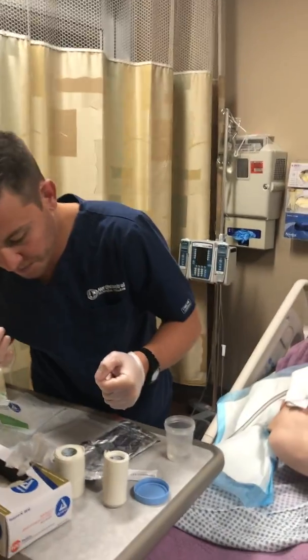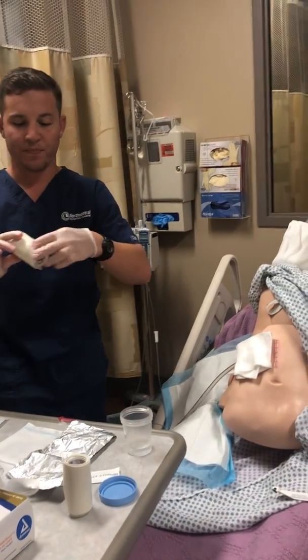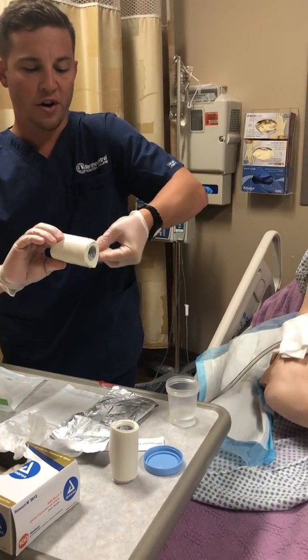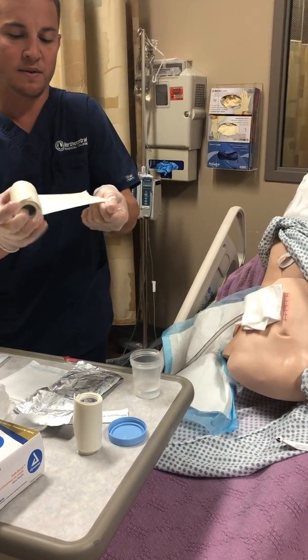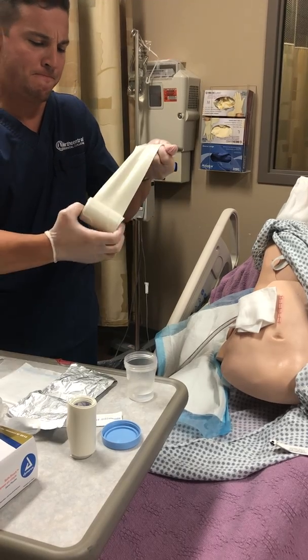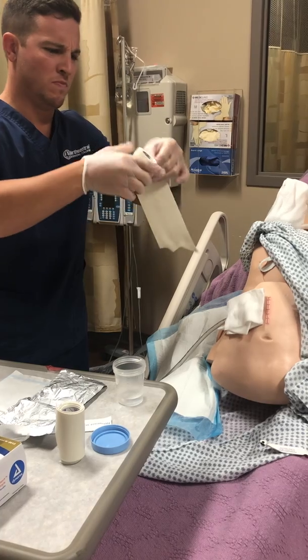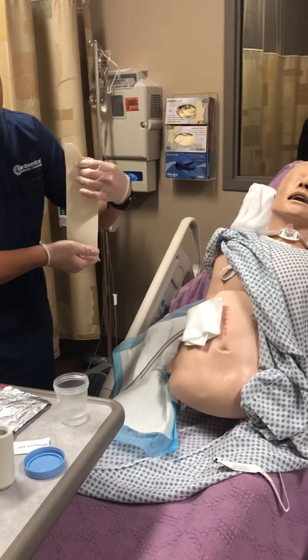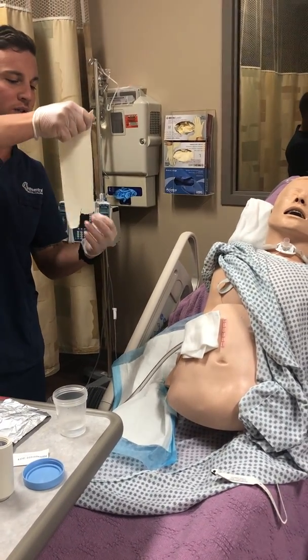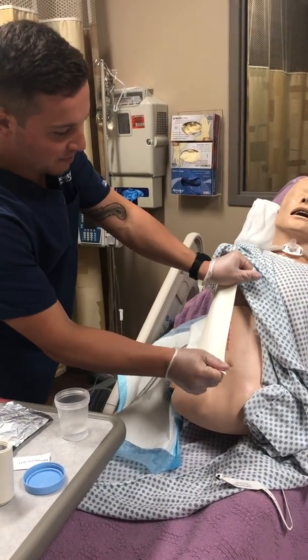Okay, so our tape here. Okay, so note here is that when I unravel, we don't want to touch the inside of our tape. Okay, we want to keep that clean. Okay, so it should take about 3 of these pieces. We're going to want to keep an airtight seal. So let's keep this out like this.